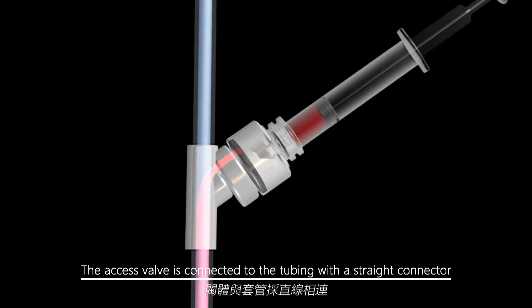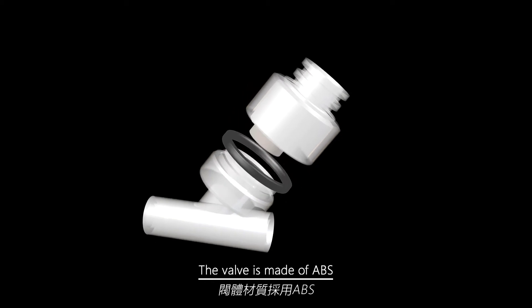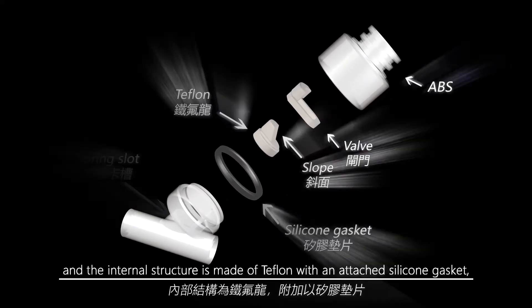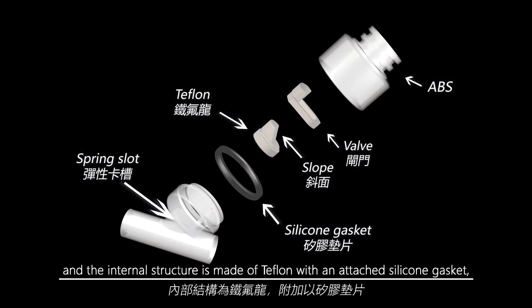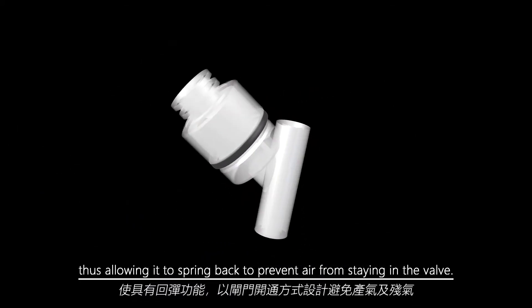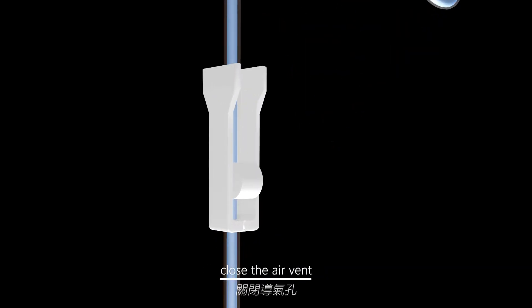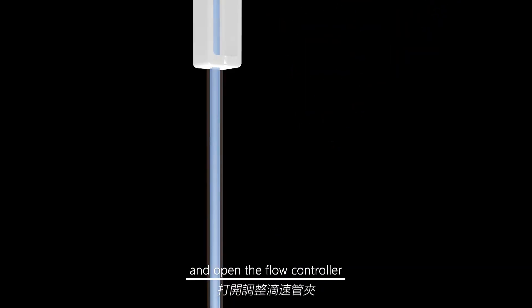The valve is made of ABS and the internal structure is made of Teflon with an attached silicone gasket, thus allowing it to spring back to prevent air from staying in the valve. Open the flow blocker, close the air vent, and open the flow controller so the infusion liquid will flow from the top of the tubing to the bottom — easy to vent and saves time.